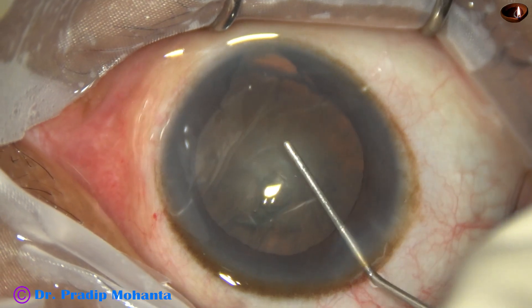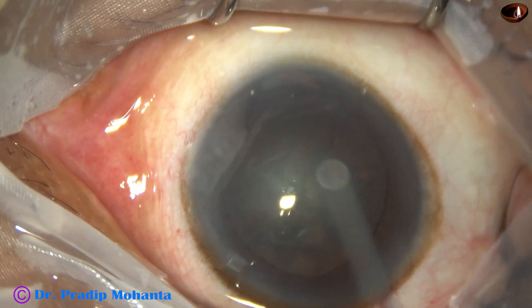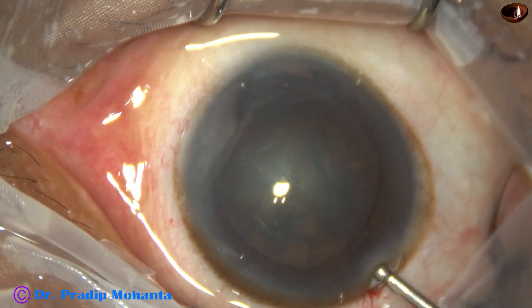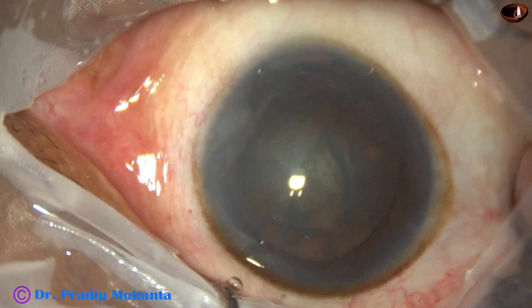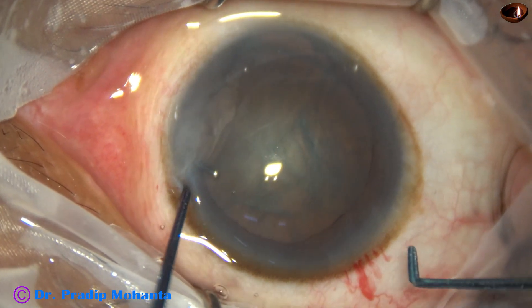We have to do this eccentric rhexis in cases of coloboma iris. If we go towards the coloboma area where the zonule is weak, there can be extension of the rhexis and the surgery becomes very much complicated.